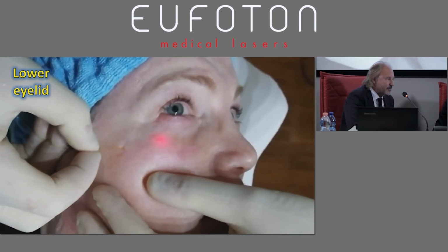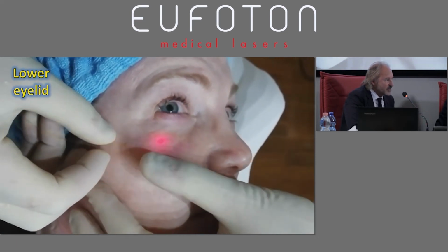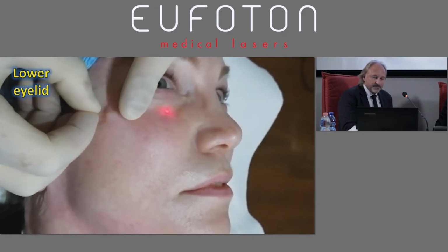I use these hybrid complexes of hyaluronic acid. They work very well on the eyelid, thus helping me with Endolift to the area, region regeneration. Good.